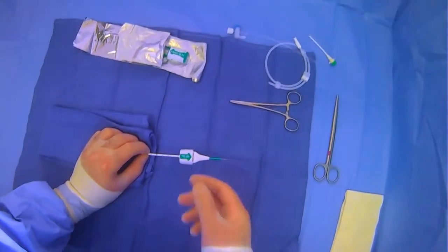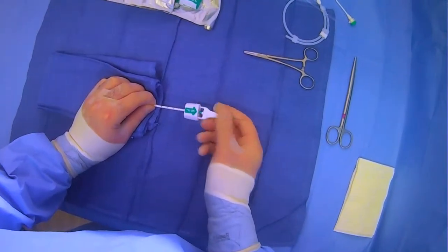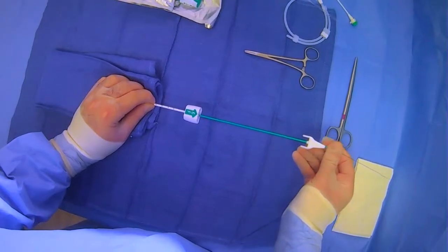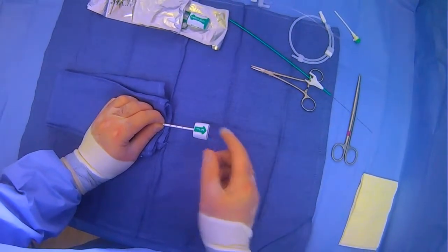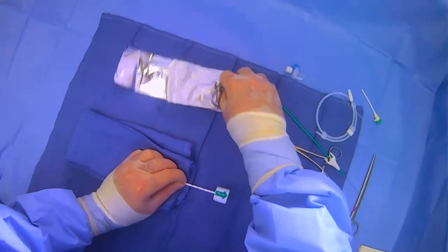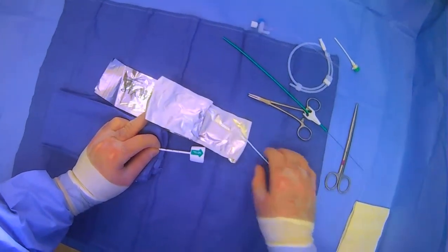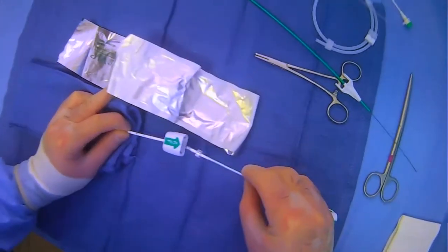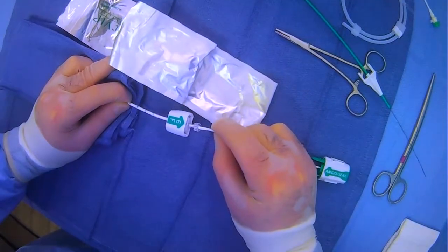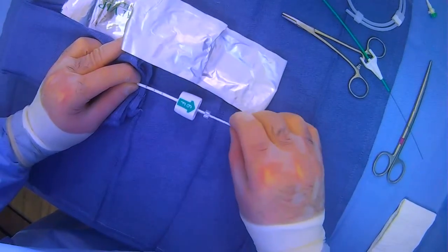This is where we want to deploy our anchor. At this point, you can grab the wire and the introducer together and pull them out, paying special attention not to move your angioseal introducer. Then you can take your angioseal from its packaging, line up the orientation, plug it in here, and push it into place.